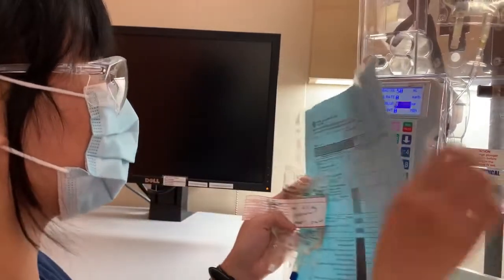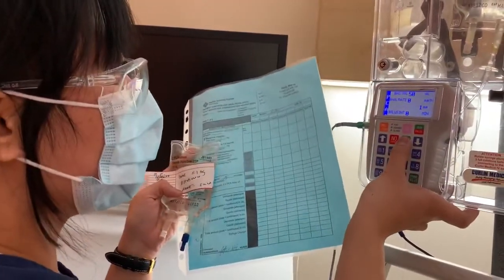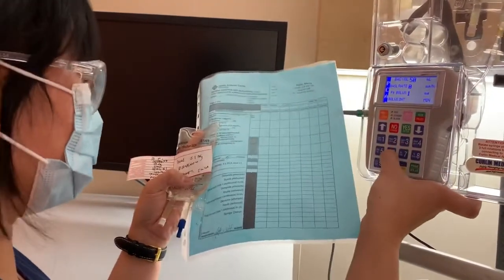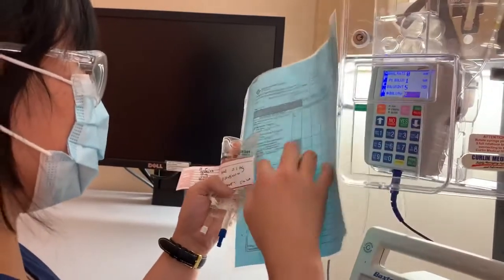We don't have any order, so we're leaving it at 0. The bolus dose is the one that we have in our order, which is the 1 milligram. We have 1 milligram right there. And we also have 1 milligram bolus in there, so that's correct. So the bolus interval would be the lockout period, which is the 5 minutes. Just gonna put 5 minutes in there. Okay, so we made sure 5 minutes. It's 5 minutes in here.